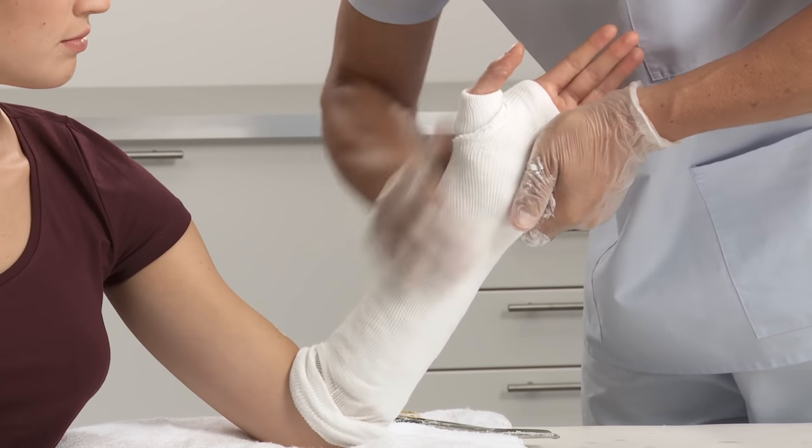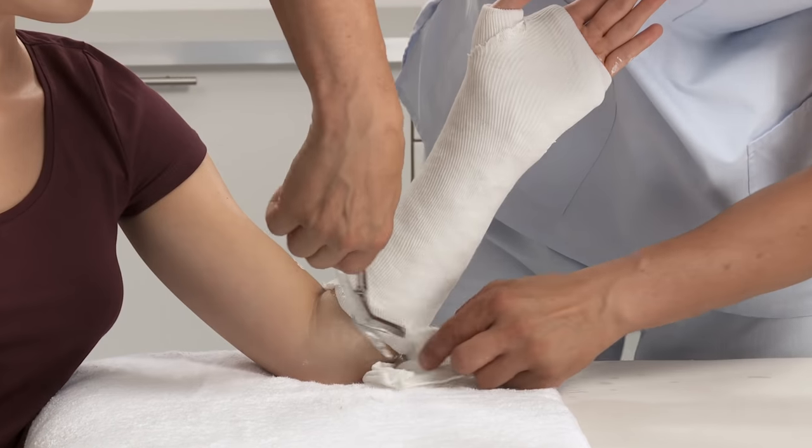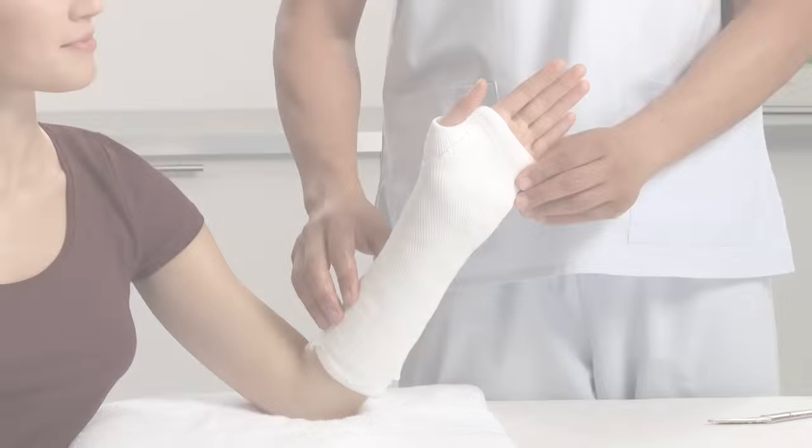After approximately 3 to 5 minutes the cast is set and the patient can be released. The cast is fully set after 24 hours.